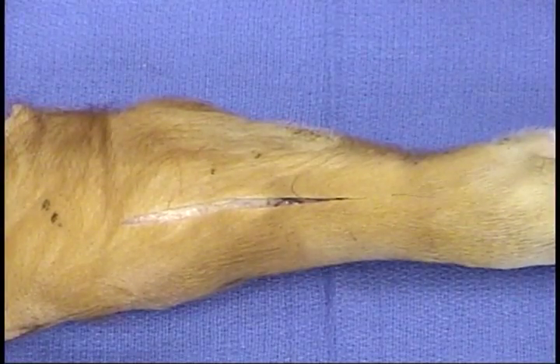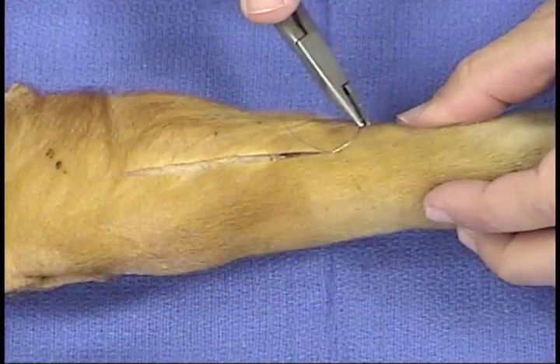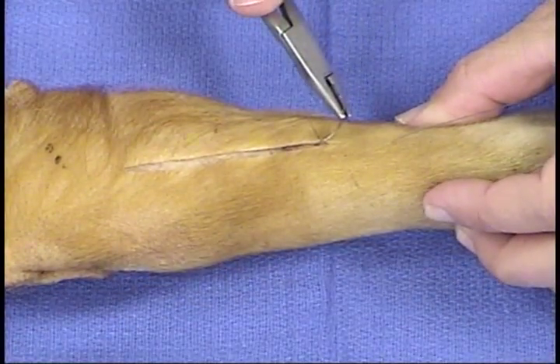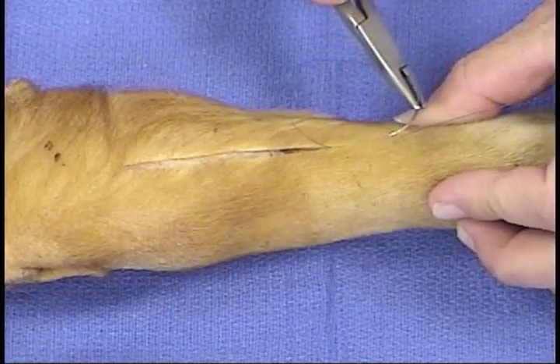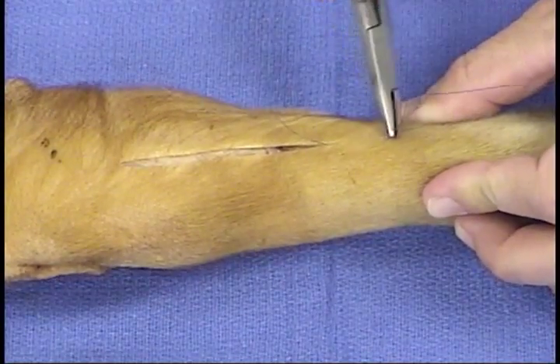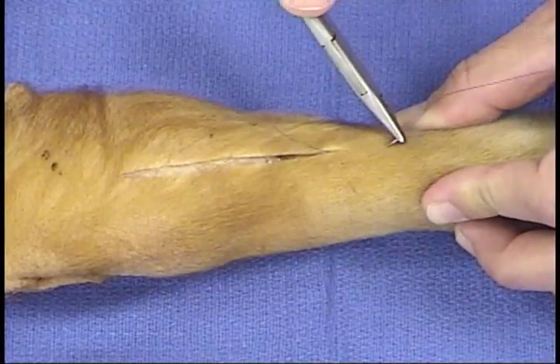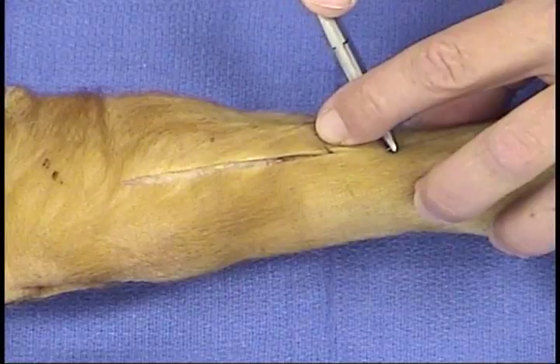Drive the needle through the commissure of the skin and take a fairly deep bite. Then come back with the needle and drive it through the exact same hole that the suture exited the skin, this time going a little bit superficial.